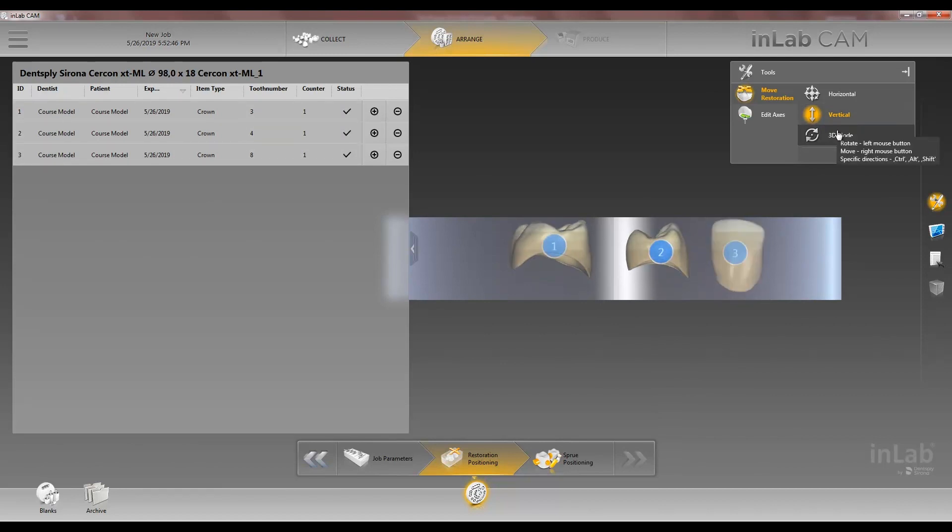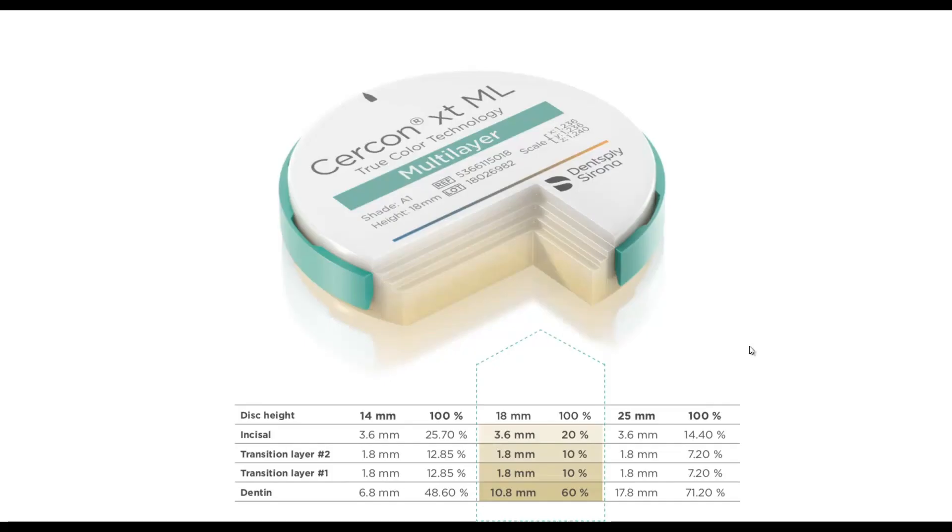You can also rotate it as well. These layers right here correspond to the layers on the Circon XT multi-layer disc shown here. Here you can see a breakdown for an 18 millimeter disc: we have 20% incisal, 10% transitional layer 2, and 10% transitional layer 1.